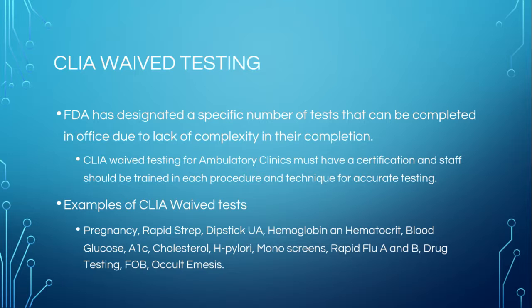Now, this is not drug testing for a job-related injury. CLIA-waived drug testing is literally, maybe a lot of doctors now prescribe opiates, so maybe they prescribe hydrocodone. They'll do random drug testing to make sure that there are not other drugs in their system. That kind of drug testing can be done CLIA waived, and it's relatively simple. They urinate in a cup, and some of them have a stick that goes in them.